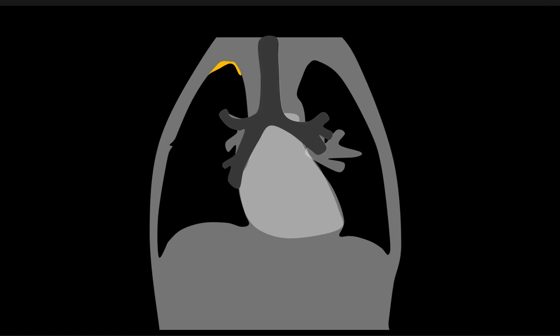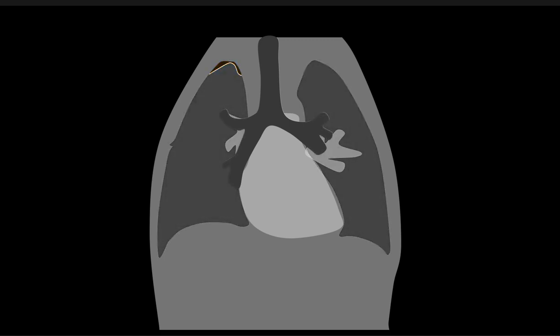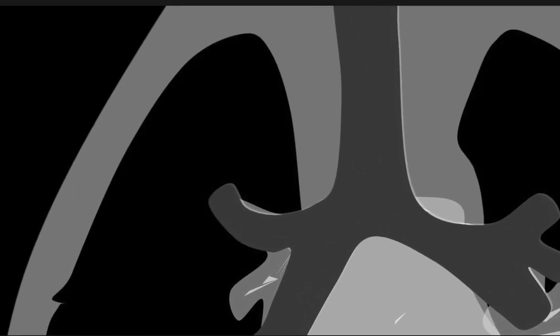So you end up, like I said, with a small pneumo. And of course, those things aren't colored orange in real life. It's going to be more lucent or darker relative to the lung, to sort of exaggerate that, sort of put that idea in your mind. And we'll talk about that in more detail later as we progress with the lecture.